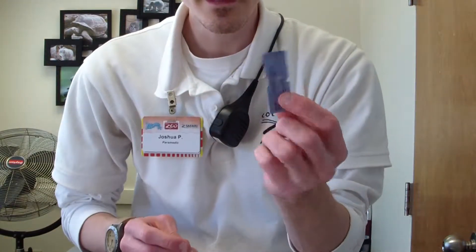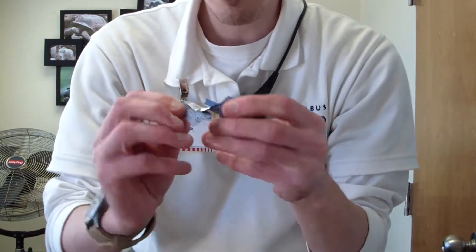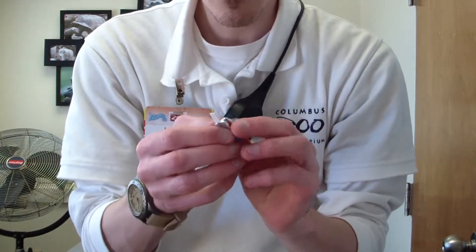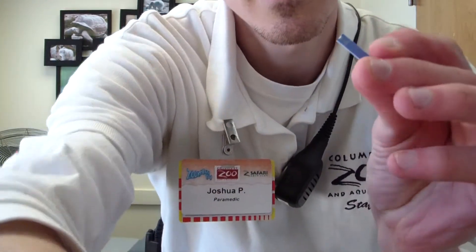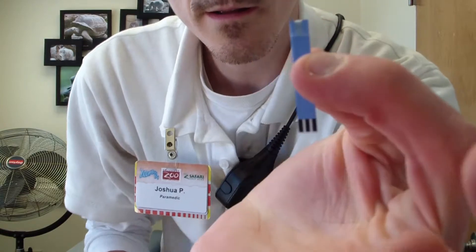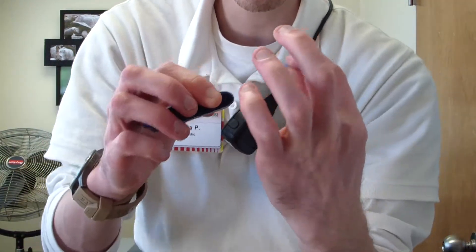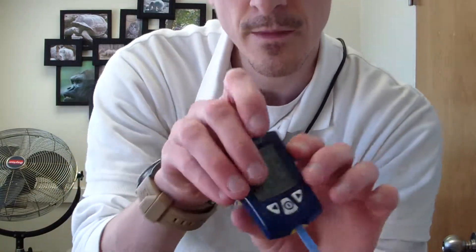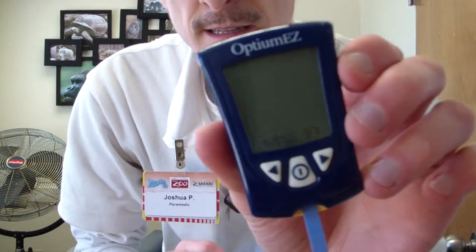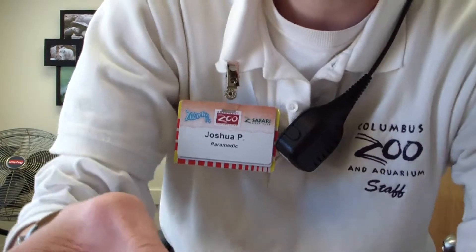Here is my glucometer strip. I'm going to tear it off like that — I tore the wrong end, but that's okay. This end, the one with the checker mark, is like a barcode, so it's going to go into the glucometer just like that. The glucometer instantly senses it and loads up, and now it's waiting for blood.